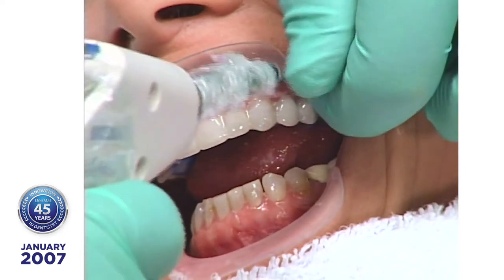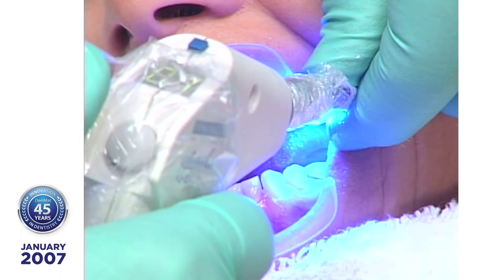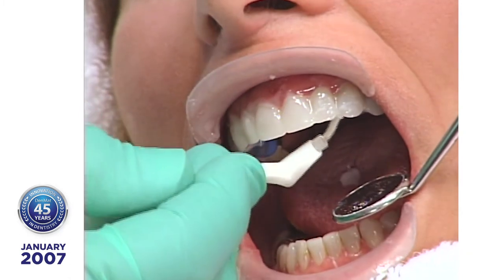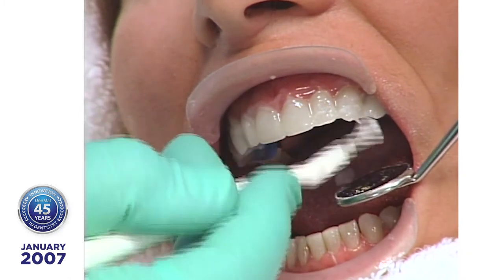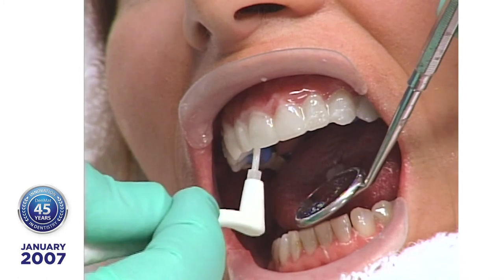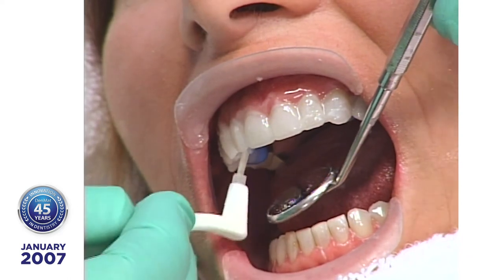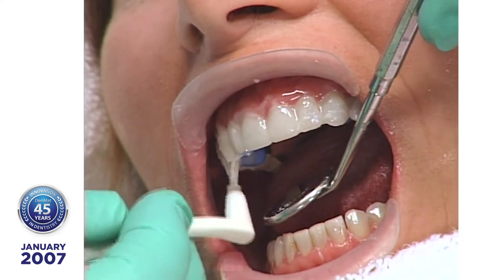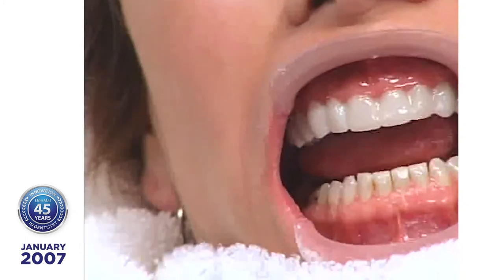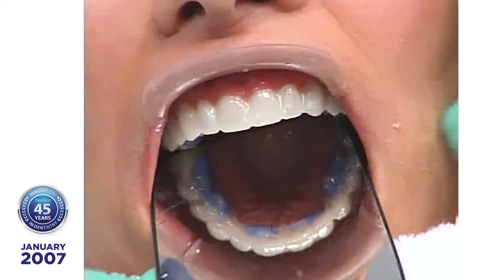We have Tenure S on the brush — you could also use Visor Seal on there too. Let's take a look at the lingual side. Once you start putting these in, the Tenure S starts causing this to polymerize even before you get the light there. So you don't want to do a try-in and find out you got the wrong shade and have already applied Tenure S to the teeth. Let's let everybody take a look at the lingual side just before I start polymerizing.